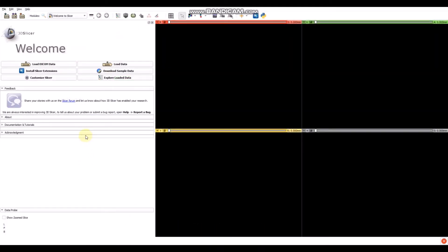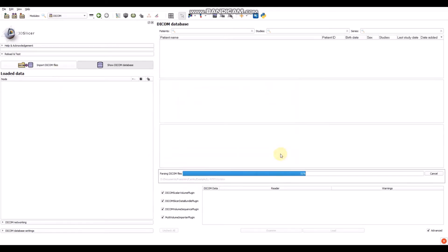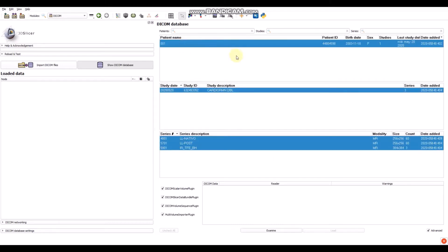Let's start uploading some data to the slicer in order to try the extension. Let's go to the DICOM module. We have to upload the data to slicer. Click 'Import DICOM file', select your folder and then wait. After that, select the sequence that you want to upload.